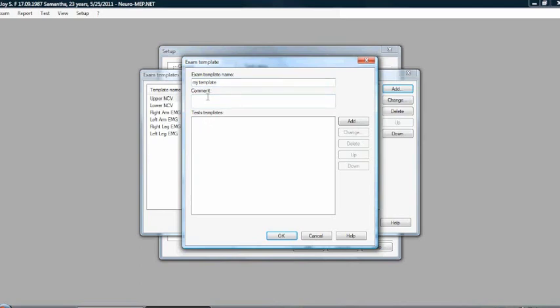Now, or I'm going to say, this is going to be Dr. Smith's template, so that she doesn't take your template, you don't take her template. Okay? This way, each time this comes up, let's call it here Smith's template to make it even easier. Here we go.